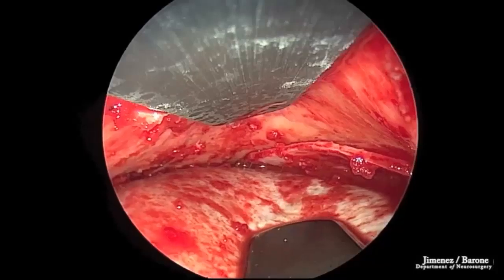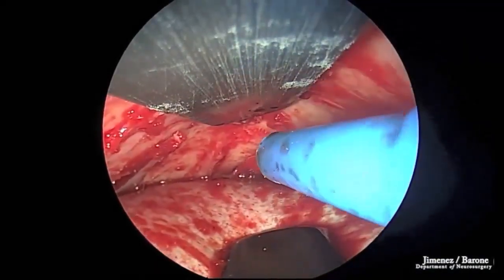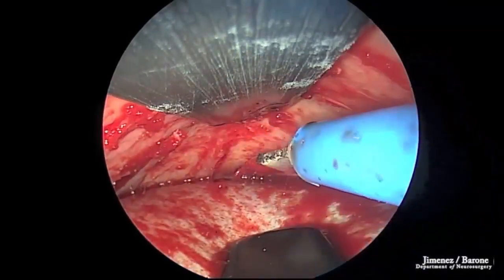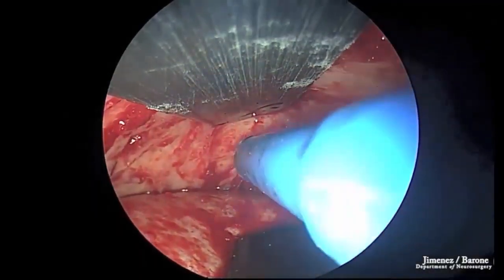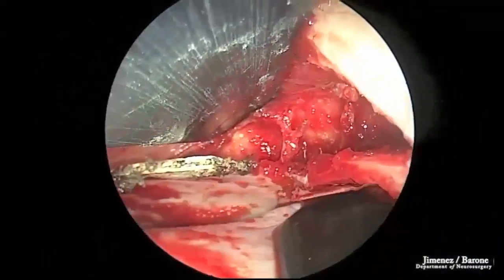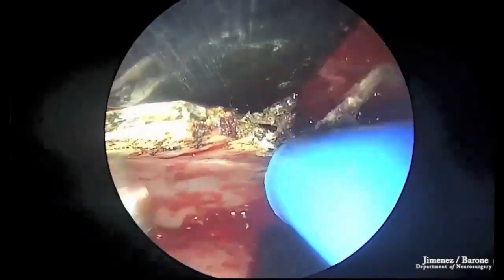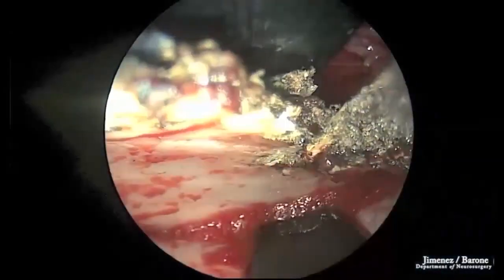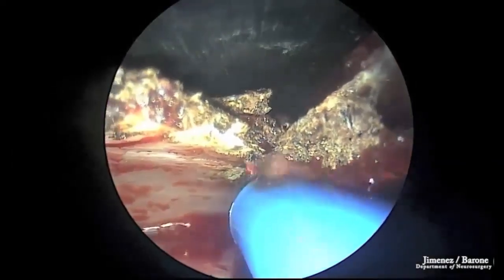Bone hemostasis is mandatory and can be easily achieved with the JMB dural retractor and suction electrocautery. The suction electrocautery is set at 60 watts. The diploic space is directly cauterized until all the bleeding stops. This is done in a circumferential fashion, including all the wedge osteotomies as seen here, as well as the paramedian osteotomies.